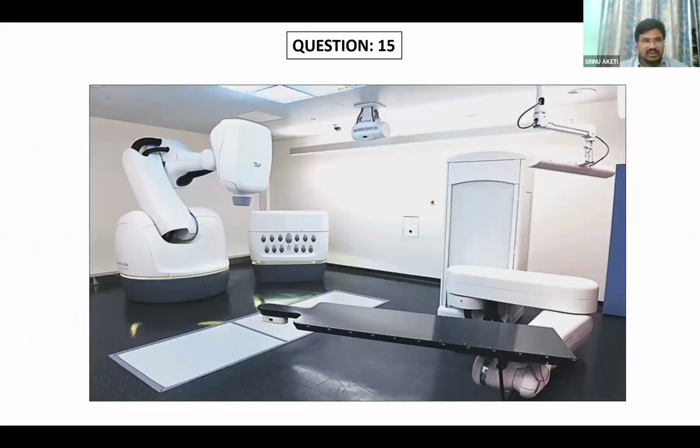Next. Have you ever seen this machine? Yes, sir. What is it? CyberKnife machine, sir. For SRS. Only SRS? SRS, SRT, and SBRT, sir.